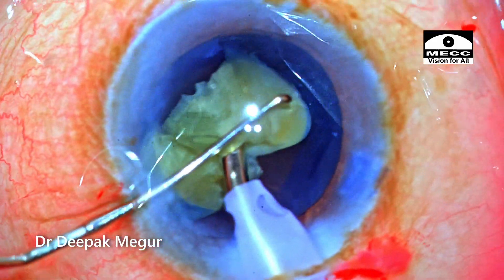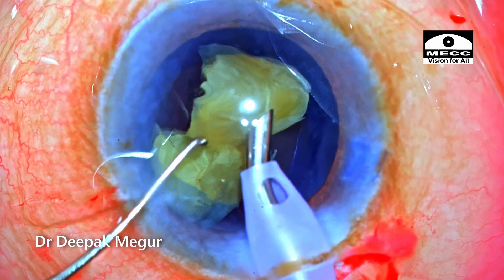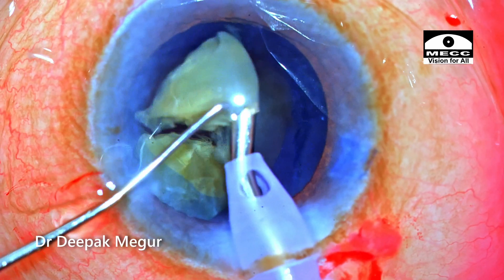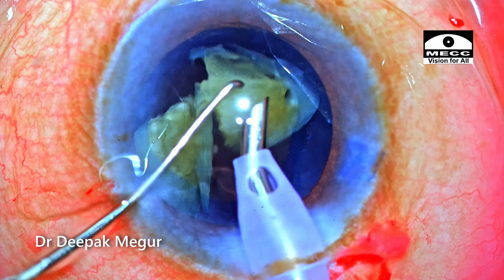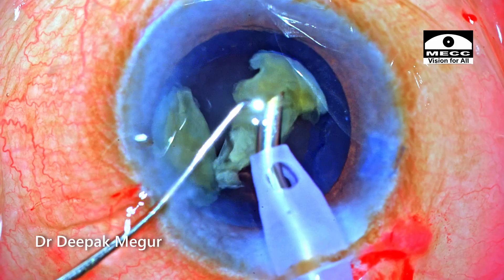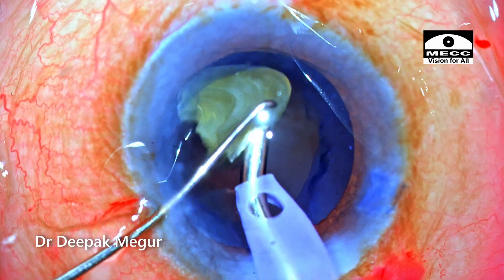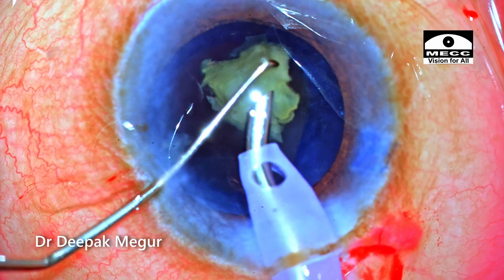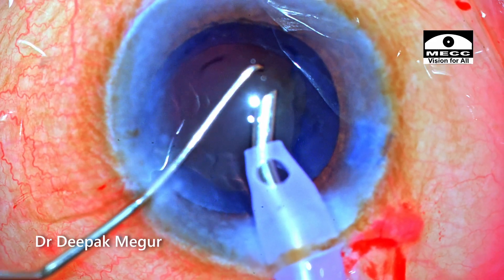Time to emulsify the last two fragments. Please note that the chopper and the phaco tip together form a sort of barrier to prevent tiny fragment pieces from flying around and hitting the endothelium. The fragment dances around the phaco tip as it is emulsified in quite a posterior plane in a very controlled manner, with minimal lens chatter and turbulence.